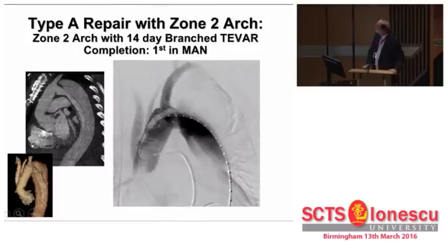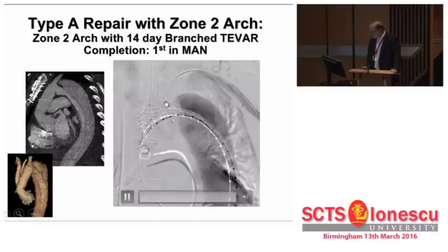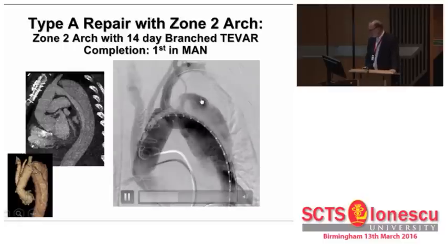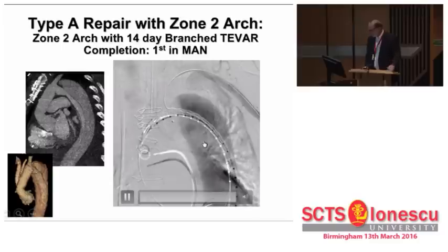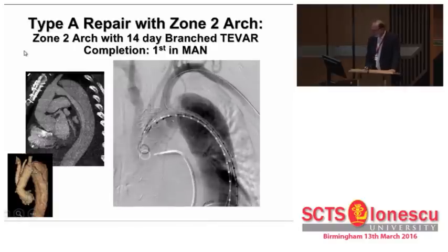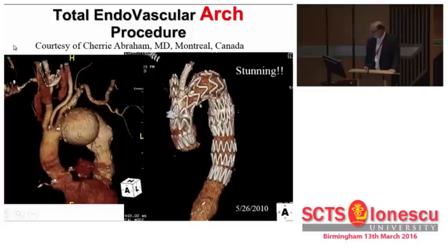This is an example of one that we just did, and I'll show you that we did this 2 weeks beforehand or so. The standard zone 2 arch operation. You can see that this was a bad case because even in only 14 days, it's already shown to be this big descending aneurysm, and so we put in the branch graft. You can see the wire in the subclavian here, and this is the new branch graft that's coming out for aortic arch work. And I'm telling you, these things are going to revolutionize the way we do business.